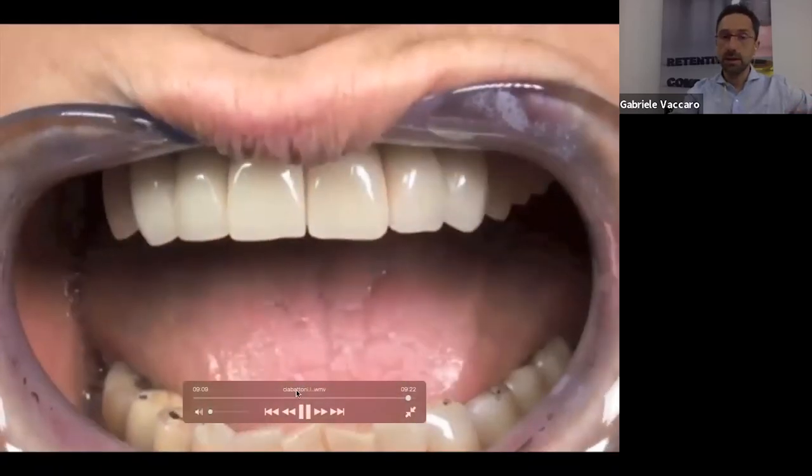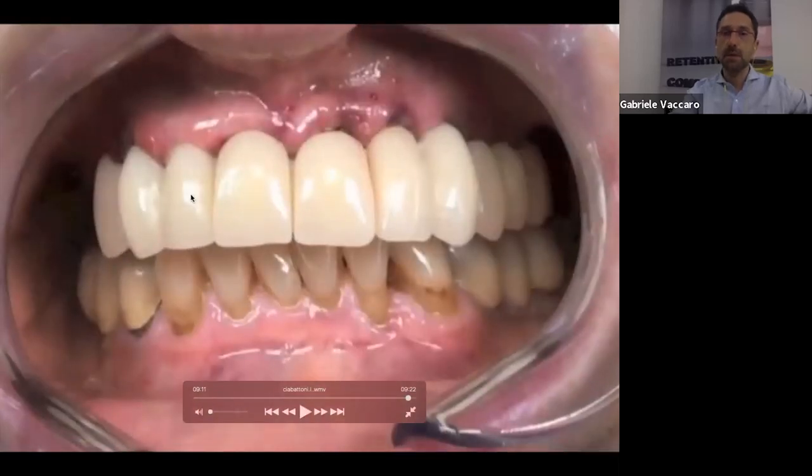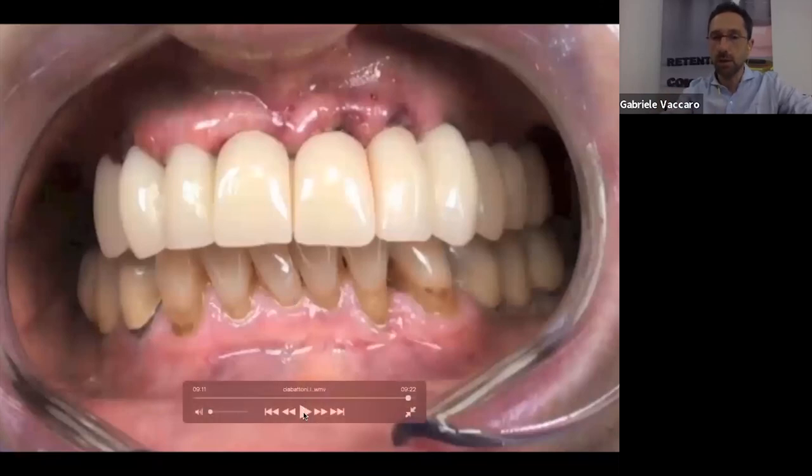And the most important, at this point, the technician gave us a perfectly finished and polished temporary bridge. Before this, the technician gave you something not finished. They gave you a framework that you had to reline over the abutment you had in your office to clean up, finish, and polish. And this doesn't exist anymore.